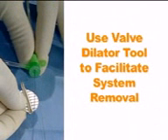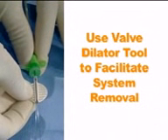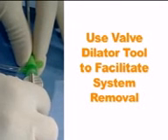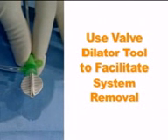If a fixed hemostasis valve is used, the valve dilator tool is required to facilitate removal of the Filter Wire EZ system. Place the valve dilator on the shaft of the retrieval sheath and slide it into the valve. Remove the sheath and protection wire from the patient through the valve dilator and then remove the dilator.